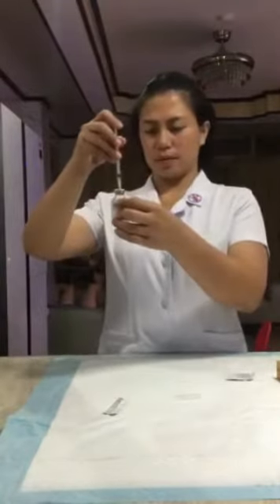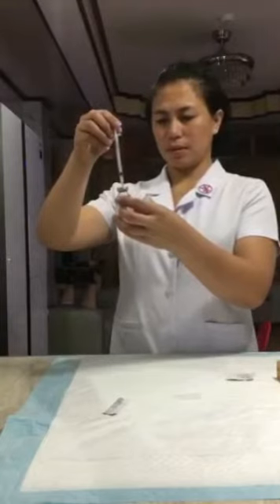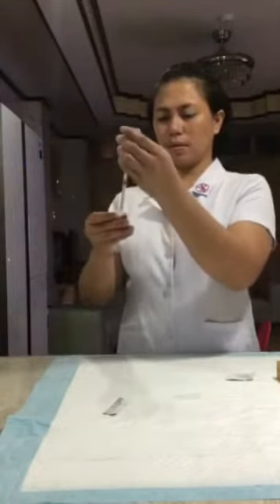The reason for this is the air will allow the medication to be withdrawn easily because negative pressure will not be created inside the vial. The bevel is kept above the medication to avoid creating bubbles in the medication. Withdraw the prescribed amount of the medication using either of the following methods. Hold the vial down, move the needle tip so that it is below the fluid level, and withdraw the medication.